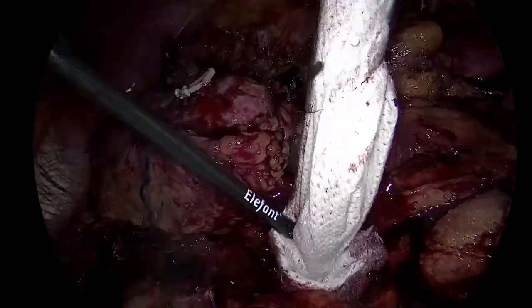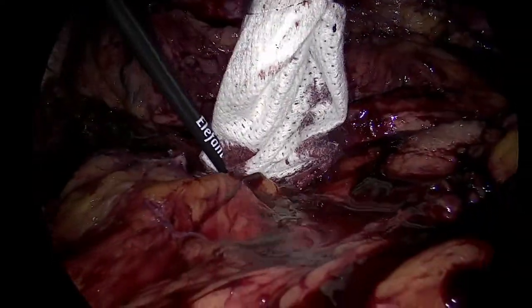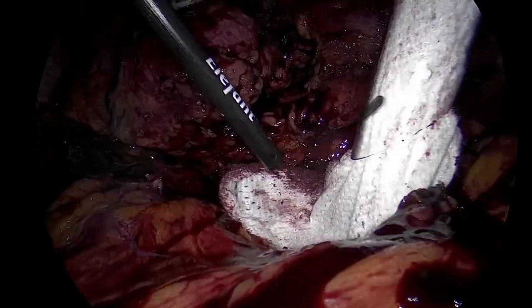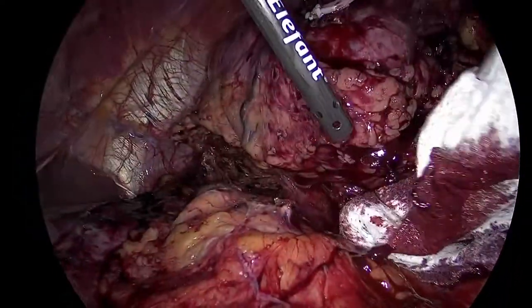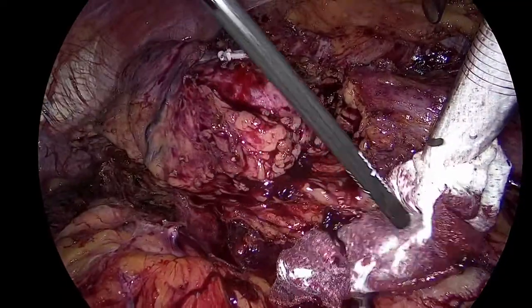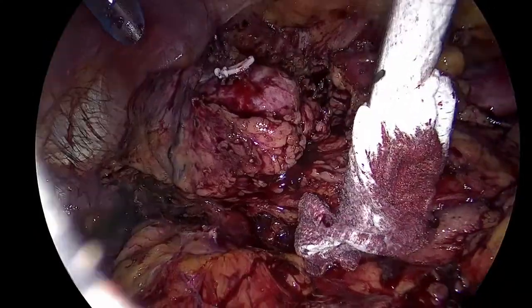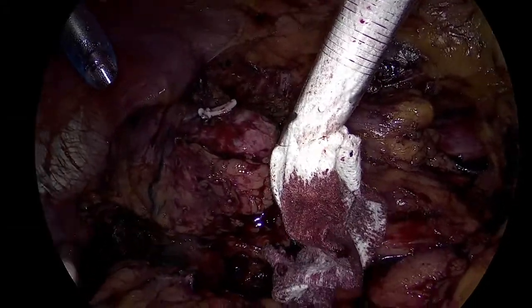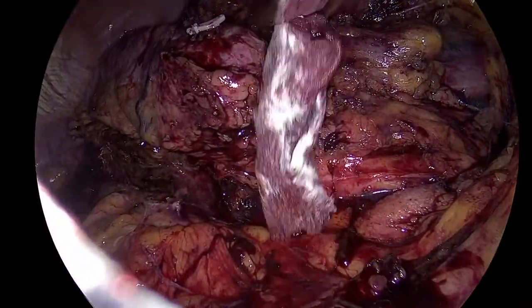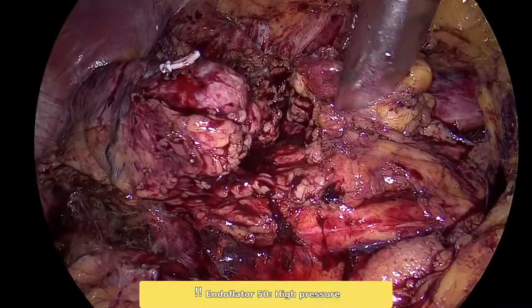Come in. Show me to the left. Come in, not on the whites, on the left. Show me the left. Yes, exactly. If you aspirate on the gauze, it's always easier. And the gauze is hanging outside of the trocar, so give me a grasper. Have it here. Hold. So this comes out, good.